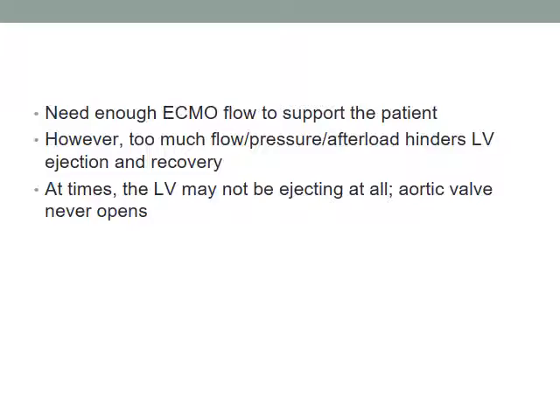That's another hour discussion on LV decompression strategies, how to do it, when to do it, if it works, how to avoid it. These are incredibly sick patients. Almost nobody's sicker than the VA patients.